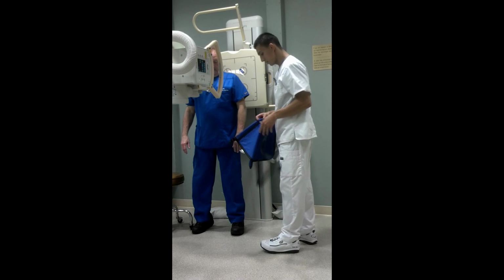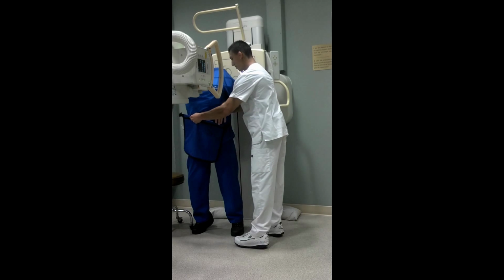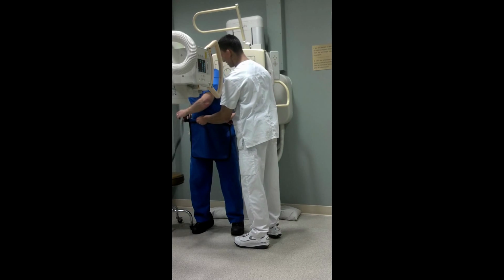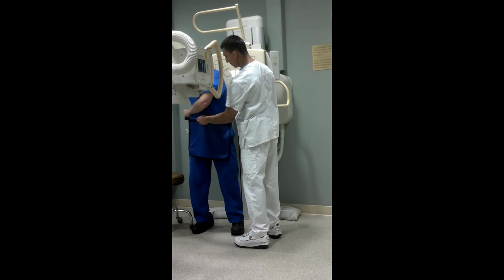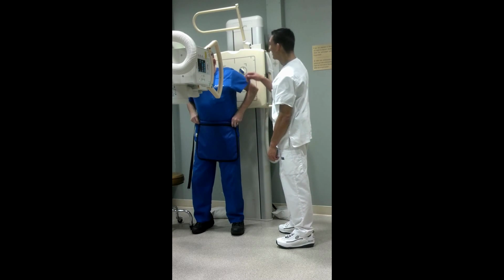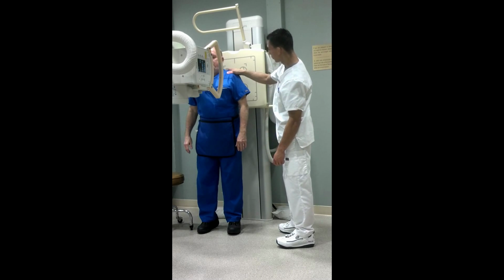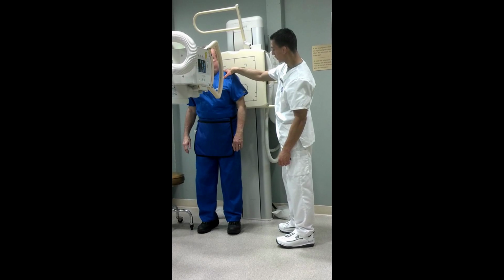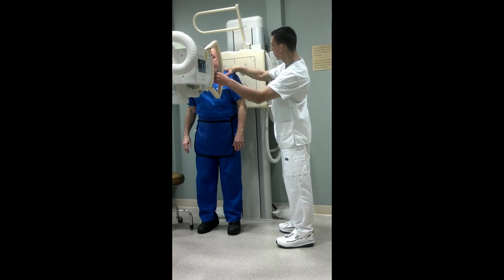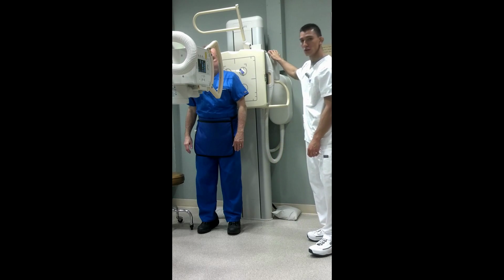And we'll go ahead and put the shield on the patient. So we have our central ray still centered up to the coracoid process, and everything's lined up with the bucky, and we'll go ahead and shoot that.